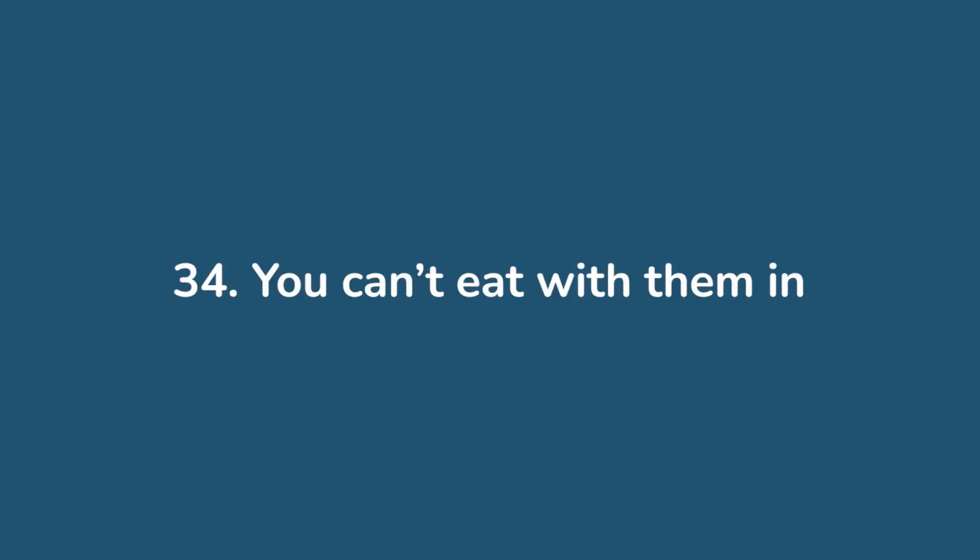Number 34. You can't eat with them in. They are not designed to withstand the forces that come with eating. They will break and be ineffective. Remove them before eating anything.